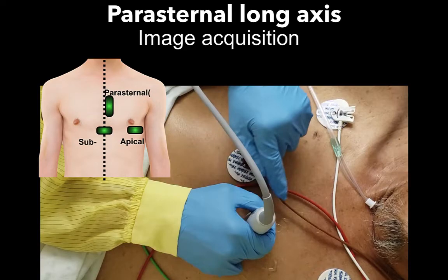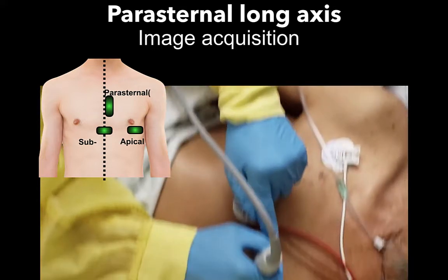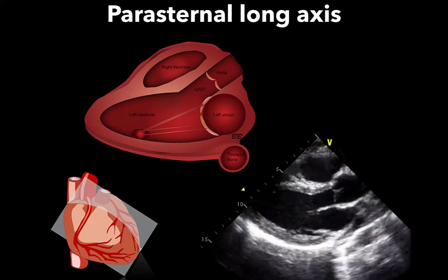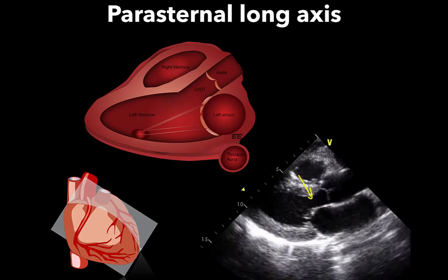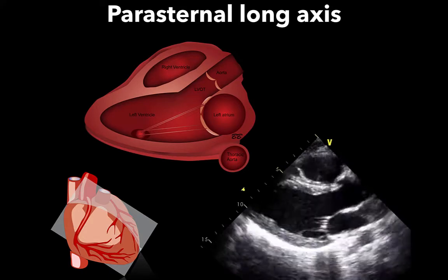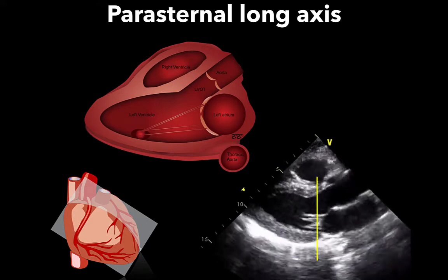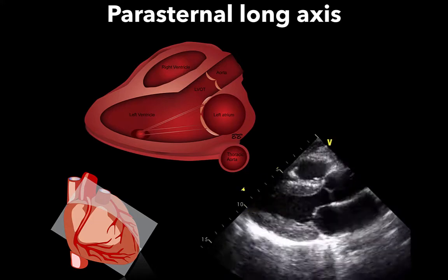Let's go over these five acoustic views or windows in real time. The first image is a parasternal long axis, obtained at the third or fourth intercostal space with the probe marker facing the right shoulder. You will obtain the parasternal long axis through the left ventricle. Here we can see a high-quality parasternal long axis showing the pericardium, descending thoracic aorta, left atrium, mitral valve, left ventricle, outflow tract, aortic valve, aortic root, and right ventricular outflow tract. The mitral valve should roughly fall in the middle of the screen, as this is the ideal parasternal long axis angle. We do not use this view to look at the apex, as you really never reach it from this angle.